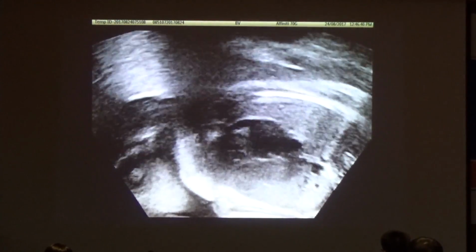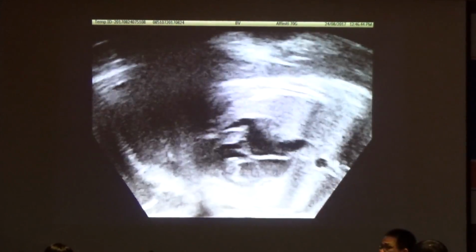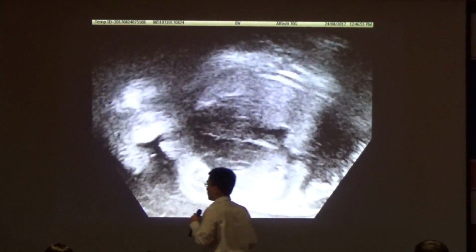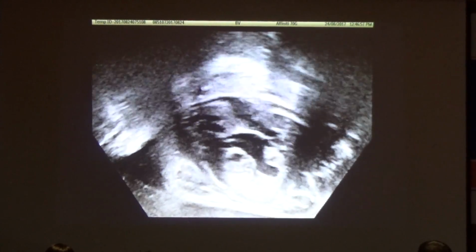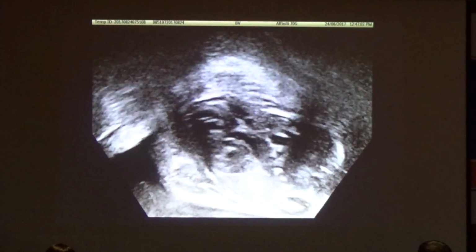Where's the aortic arch? Khi chúng ta thấy nó nhỏ như vậy, chúng ta phải kiểm tra cái cung động mạch chủ, bởi vì nó sẽ có một số cái bất thường, ví dụ như đó là hẹp eo động mạch chủ. See, there's pulmonary artery and there's the aorta in the front of it. Where's the arch? Đâu là cái cung động mạch chủ?